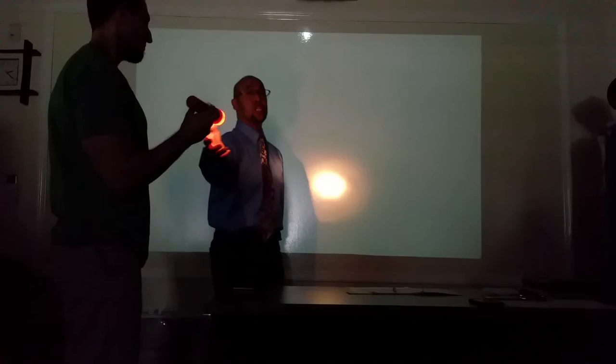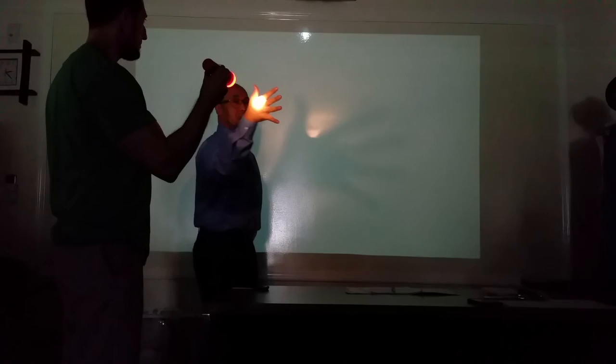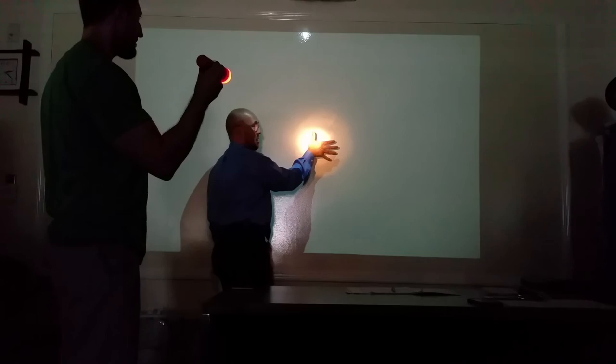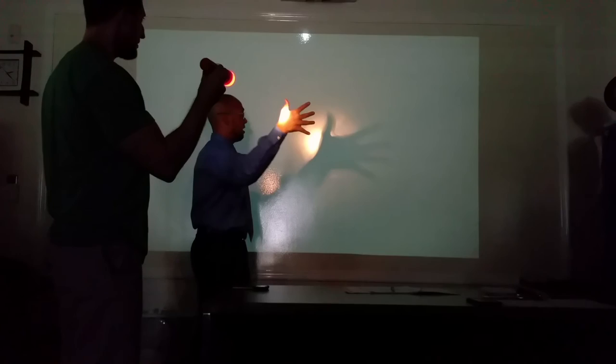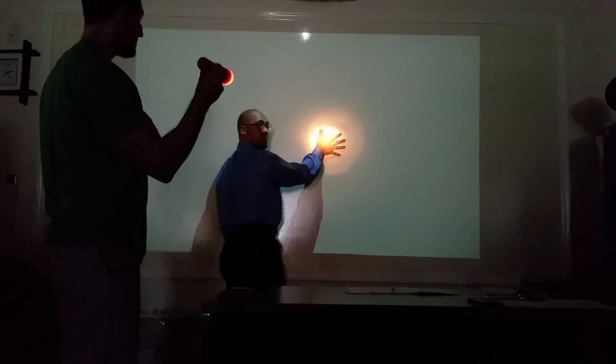Number two, if the tube stays the same, what I can do here is increase my source to object distance. This is the same thing. The distance from the object to my source. I am increasing the distance between my hand and the source. As it gets closer, it gets less detail. The closer my object is to the source, the more magnification and less detail that I have. And then lastly, your OID. The closer the object is to my image receptor, no magnification, better detail.